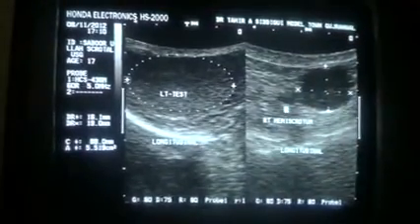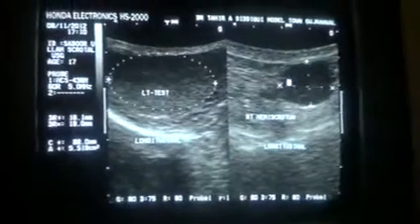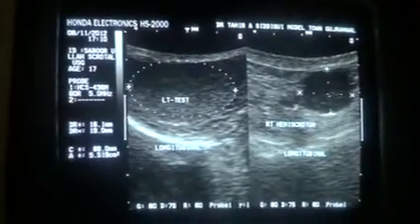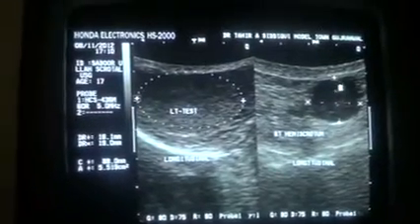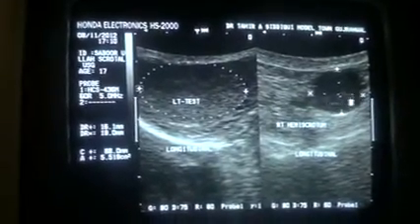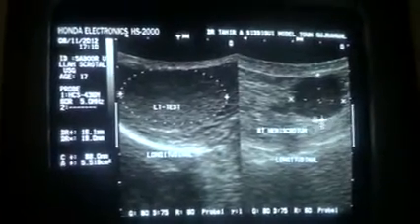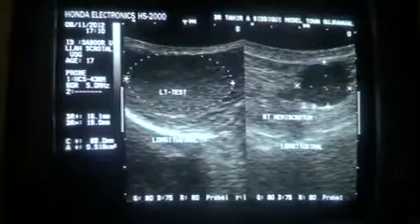with no testicular tissue seen in it, and only a hypoechoic area is seen measuring 19 by 16 millimeters with no calcification in this hypoechoic area, and faint posterior wall acoustic enhancement definitely present, well demarcated.